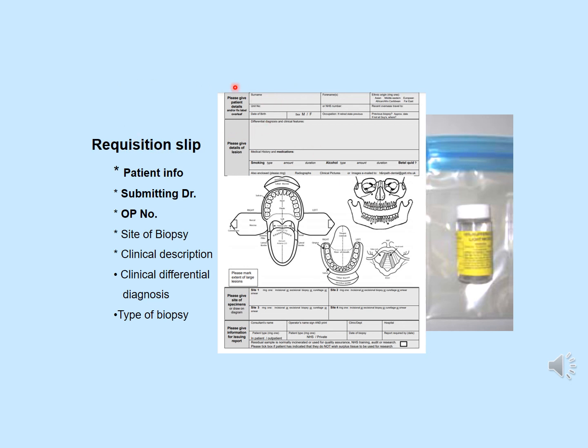All other tissues, when you submit a biopsy, you will have something like a requisition form that needs to be submitted. This requisition form has to be filled out by the operator or the assistant. Many times when you're assisting, you would be helping out the operator to fill it up. At the dental school, the operator is usually the lecturer and you are observing and assisting on most of these procedures, but you sure help out in filling this out.